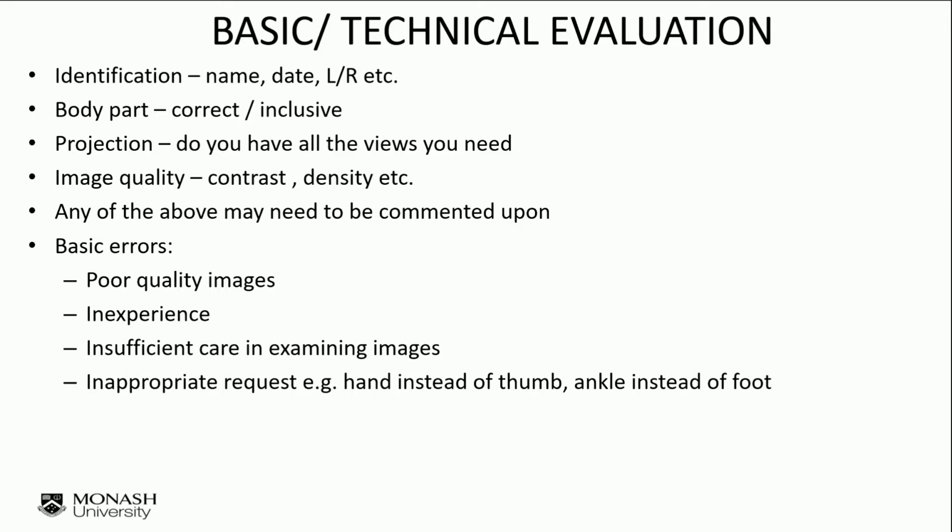So some of the basic areas that you need to try and eliminate. If there's very poor quality images, it's important to find out whether this should be repeated to get better quality images. And if it can't be, perhaps because of the patient's condition, then you need to report on that. Remember, inexperience can result in either missing a pathology or overcalling on a pathology, and insufficient care in examining images.